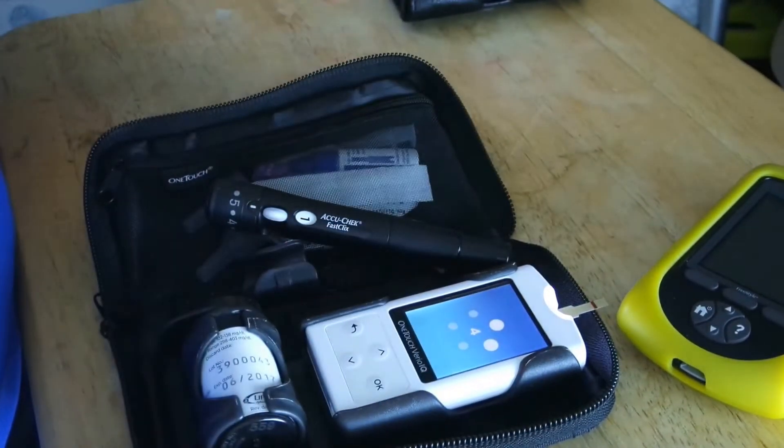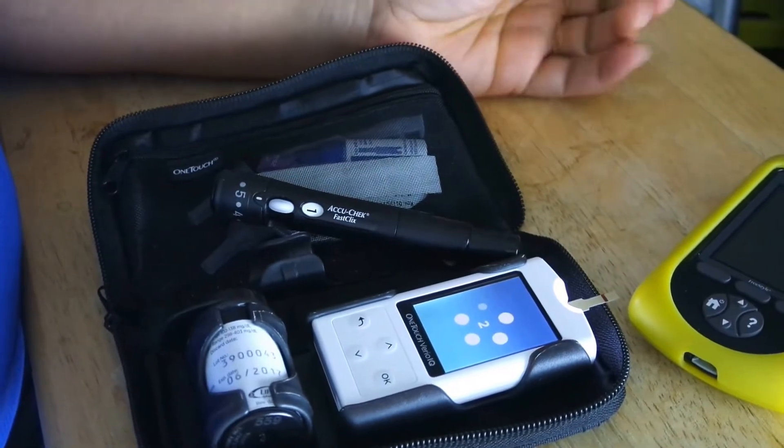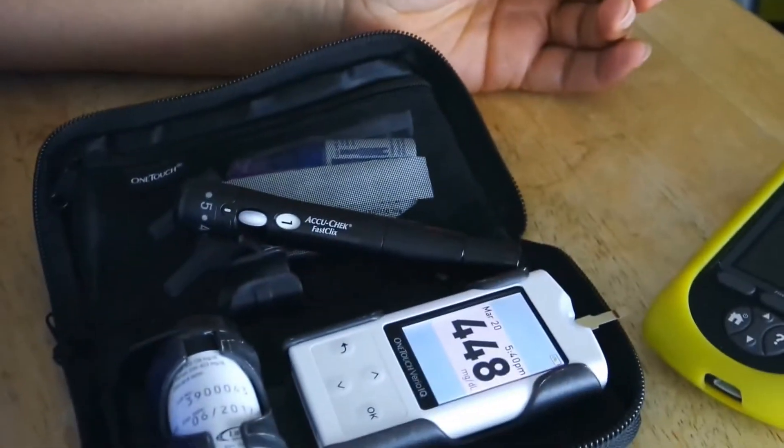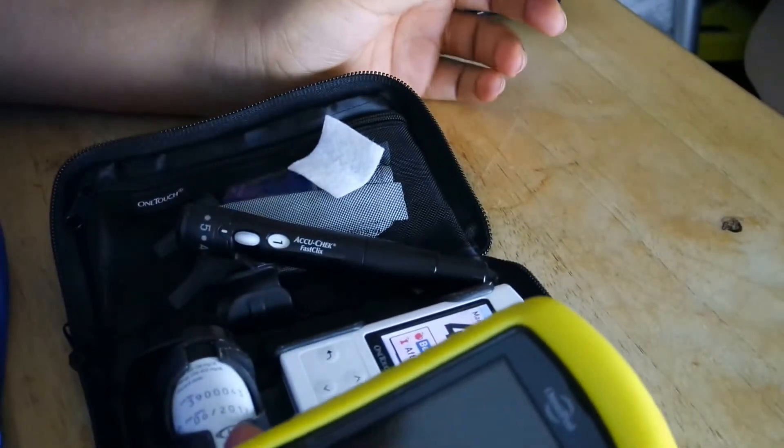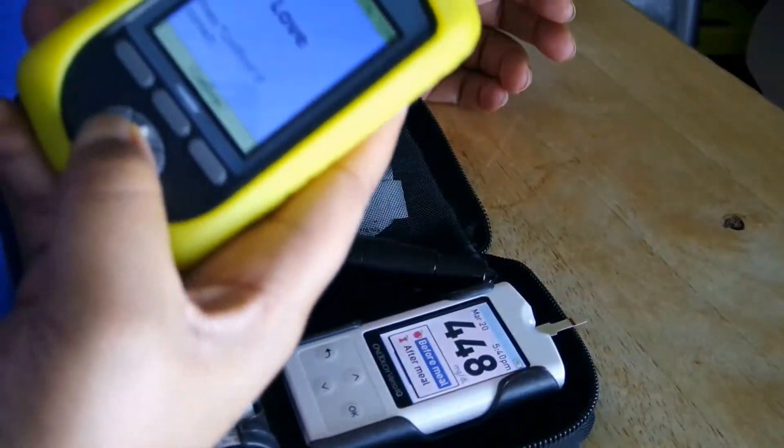It takes five seconds. The camera shake was pretty good — my number is 448, and that is extremely high.